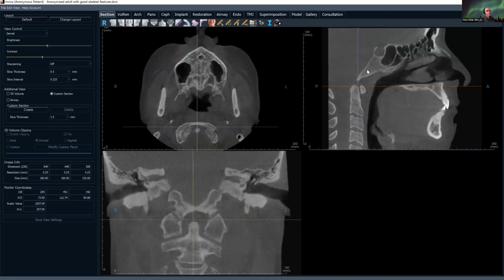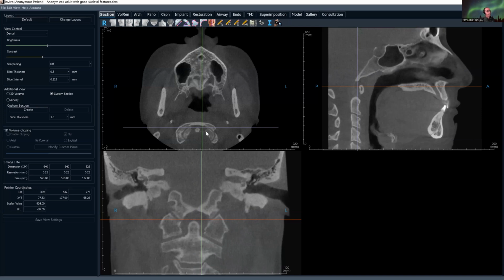This is probably the best view of the cervical spine for identifying sclerotic changes, osteophyte formation, etc. You have the anterior and posterior ligaments here. Those can ossify. And again, that's not necessarily pathosis. It's maybe a physiologic change. It's not necessarily arthritic changes, but it may accompany it. And you may see sometimes a strikingly dense band of this ossified structure. So you have the anterior and posterior ligaments that can ossify. So it gives you a look at that. I scroll through quickly.